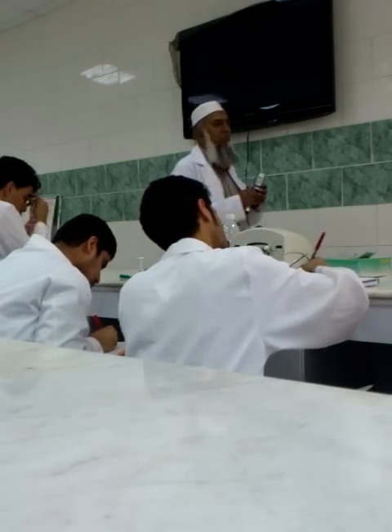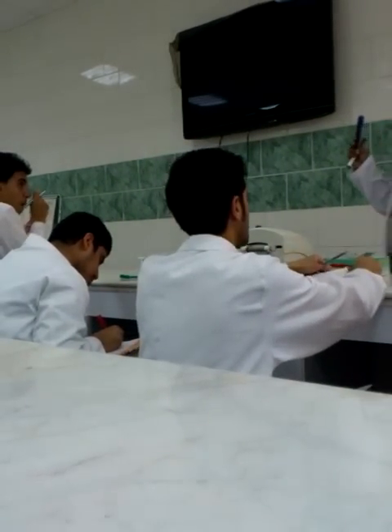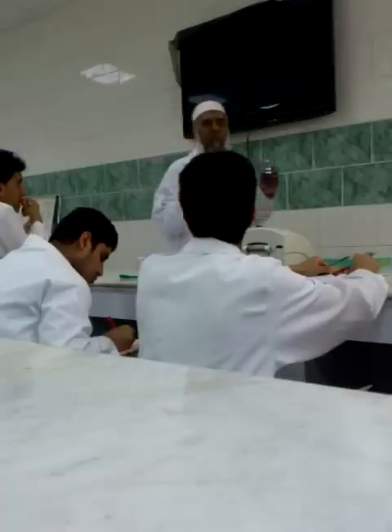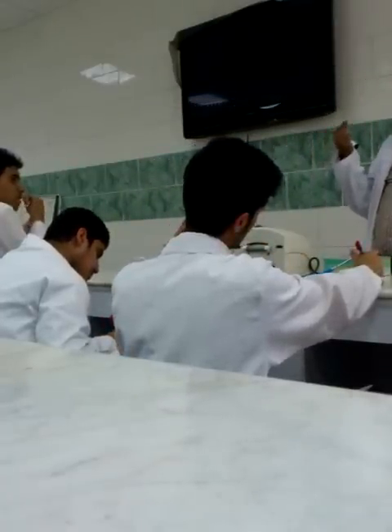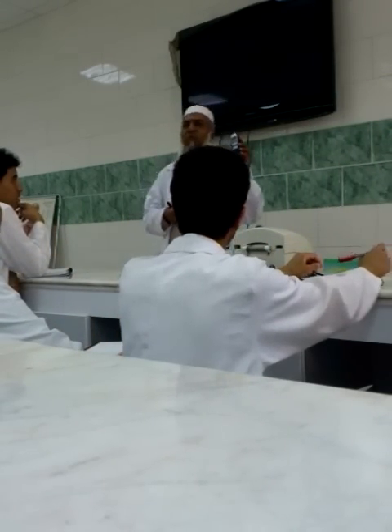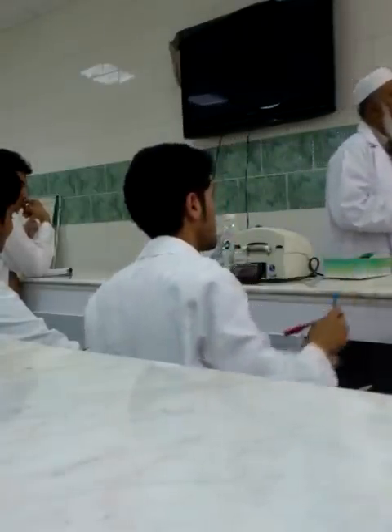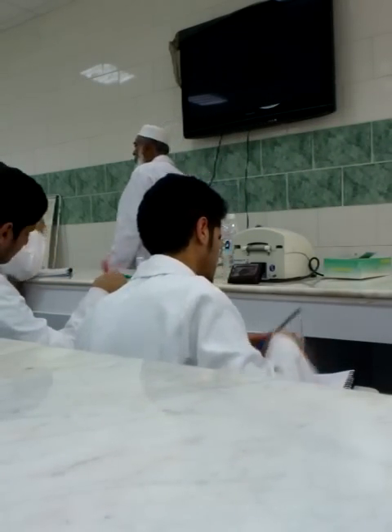Today we will also see how this glucometer works and how we can use it to determine glucose within a few minutes, with just a single drop of blood. That's why this instrument is now very common with diabetics. So two parts. First part, let's see the effect of exercise on blood glucose level.